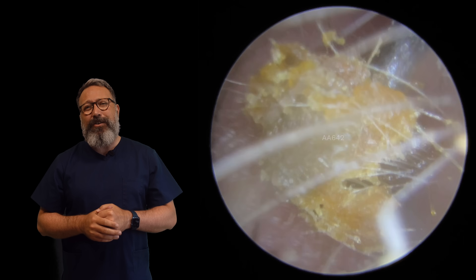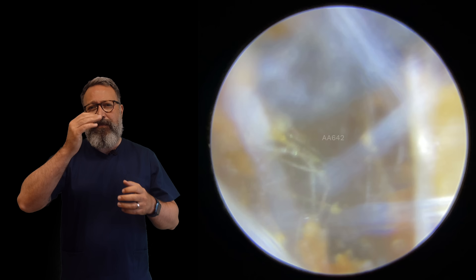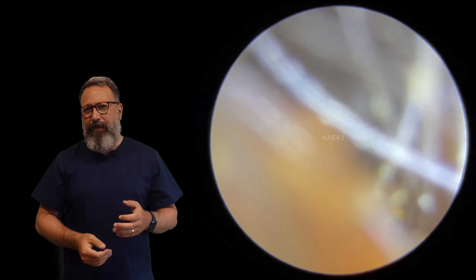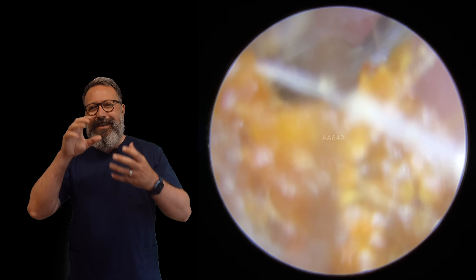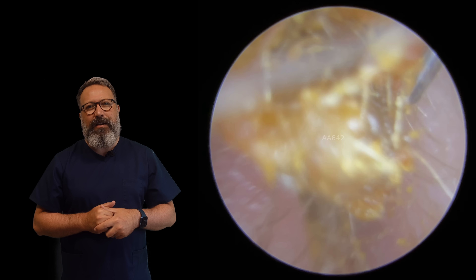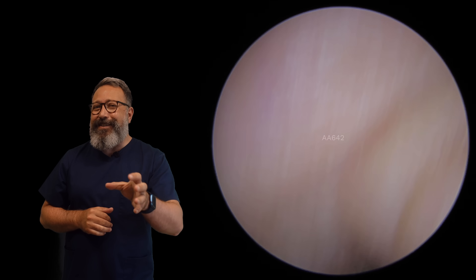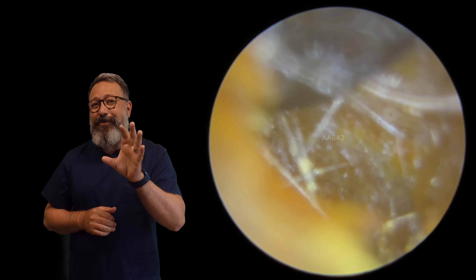We're just breaking chunks off, and what that's going to do is allow me — once I've got a little bit of the front end of this wax gone — to push the endoscope in just a little bit further. That's going to help with our view; we're going to be able to get in on top of the wax and get past those cilia on the outside edge. We're really starting to break this down — make sure you stay tuned to the end to see just how much came out of this ear canal. There are some big chunks on their way.